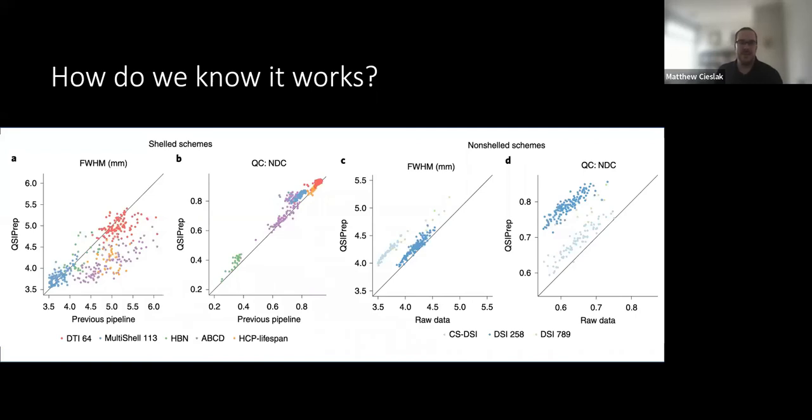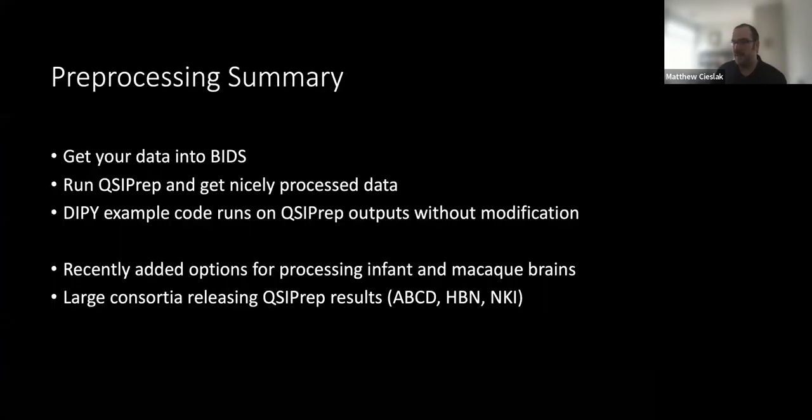And if you invert that and do a weighted average of their image-wise correlation coefficients, it gives you an idea of how consistent those images are based on how close they are in Q space. So you can calculate that for any sampling scheme, and we did just as well or slightly better than the other pre-processing schemes. And for the non-shelled schemes, the random and the Cartesian, we did better than nothing. So that was also a great accomplishment.